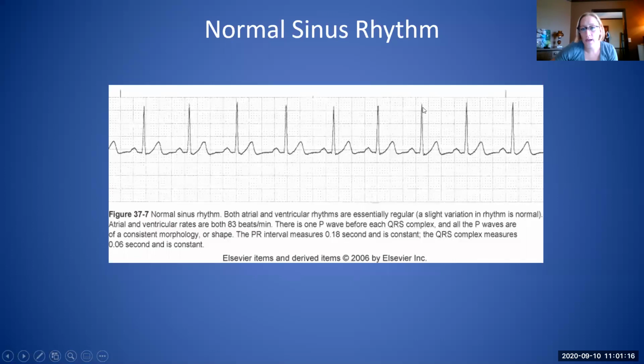Yeah, 3 and like a half, right? Because it kind of goes in the middle of this one. So we have 3 and a half. So then all you do is divide 300 by 3 and a half. What does that give us? 85, almost 86.